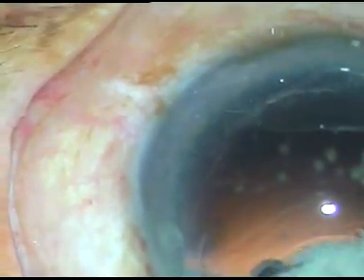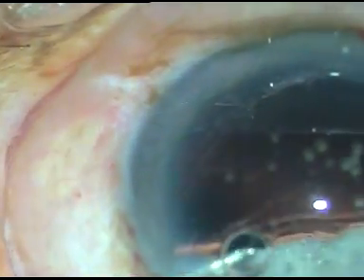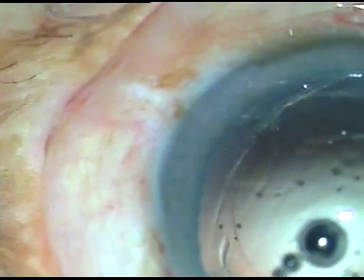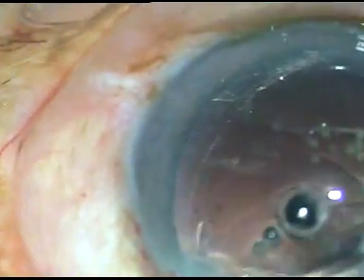Now I am injecting a bit of Kenacort and most of it sank into the vitreous cavity.